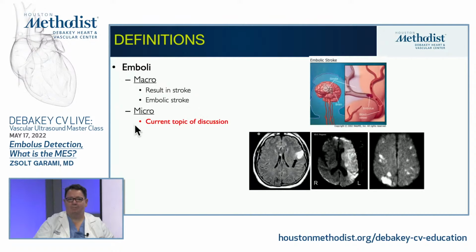So when we talk about microembolus signal, again, probably the TCD is able to pick up anything from 10 micron. So the microembolus signal is going to be our 10 to 100 or 200, and the macroembolus signal is going to be the 200 micron size. And this is where we really want to focus today on the microembolus signal. And again, it's not a new thing.